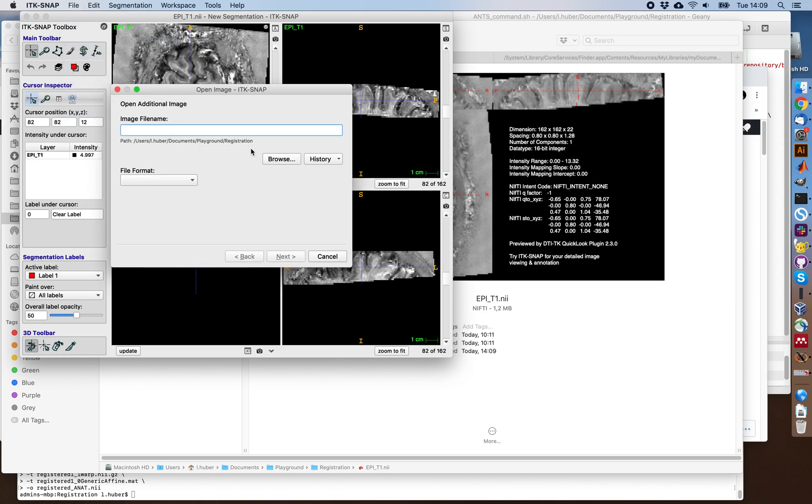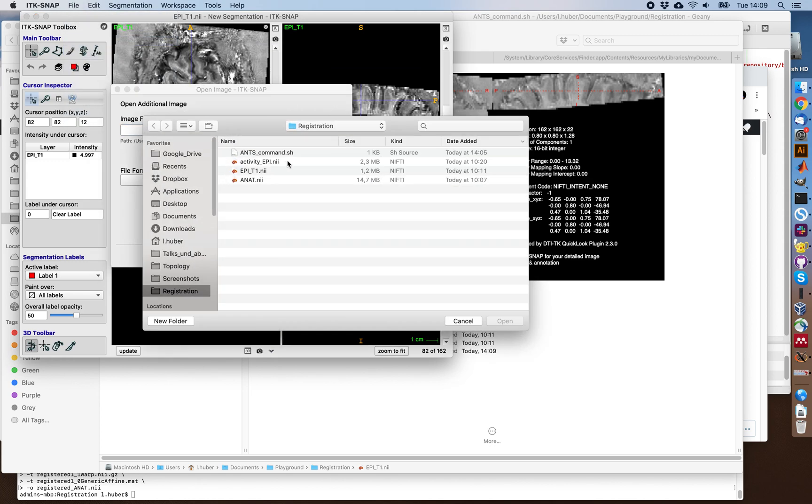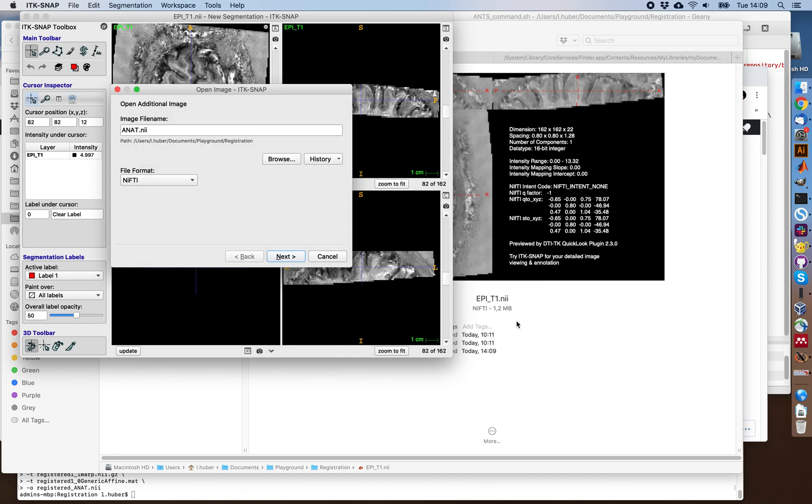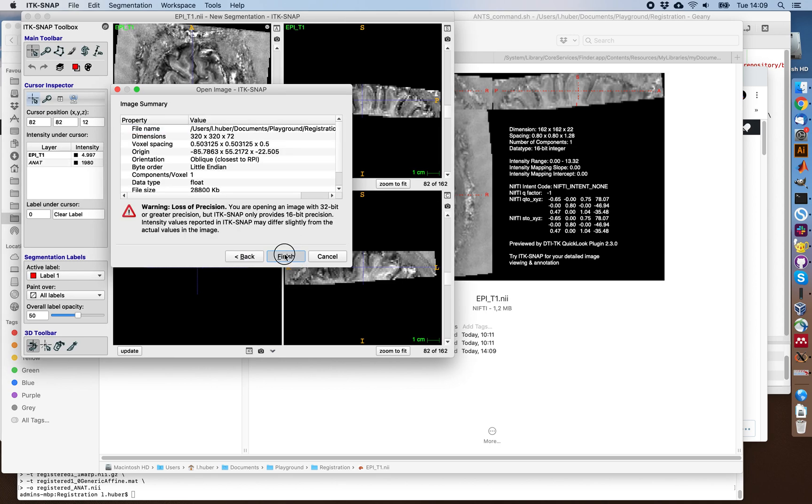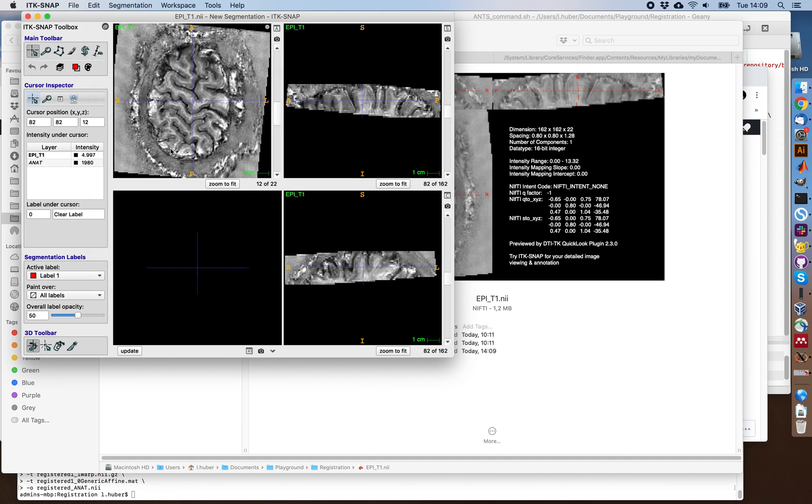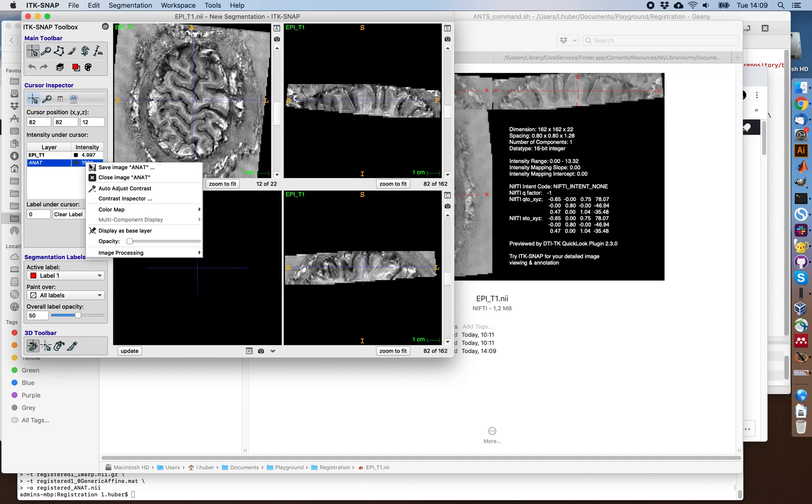For example, the high resolution anatomical MP2-RAGE scan, which would be the ANAT.NII. And I usually try to overlay them as semi-transparent. And this means that we have both images available.